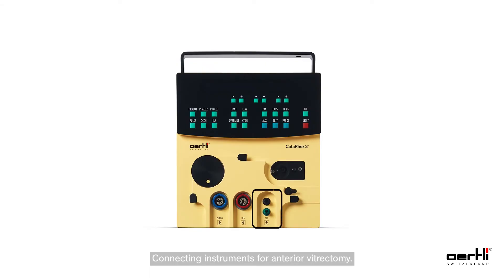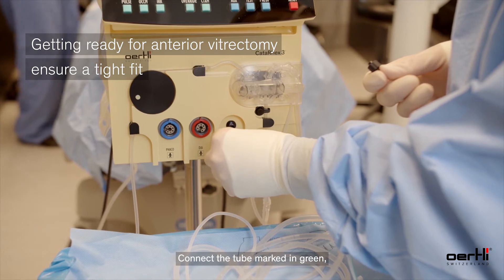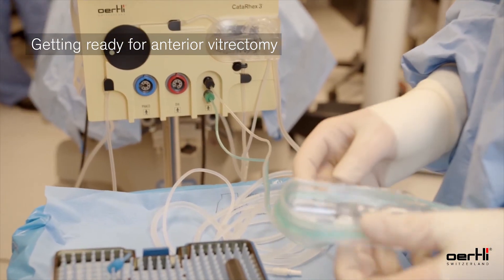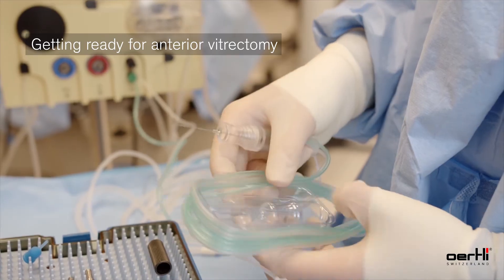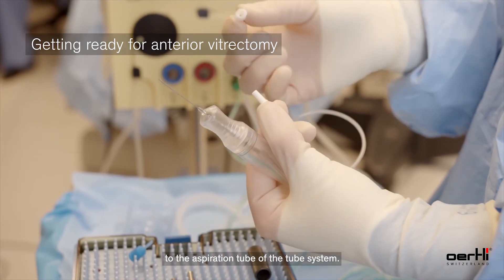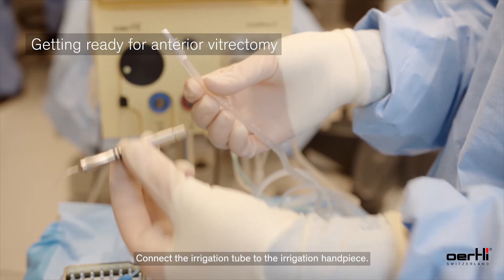For connecting instruments for anterior vitrectomy, connect the tube marked in black to the lure port on the machine marked in black, turning it a quarter turn to the right. Connect the tube marked in green to the lure port marked in green on the device, turning it a quarter turn to the right. Connect the aspiration tube of the vitrectomy instrument to the aspiration tube of the tube system, and connect the irrigation tube to the irrigation handpiece.